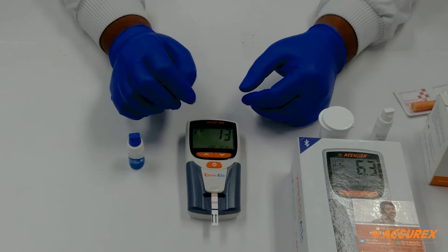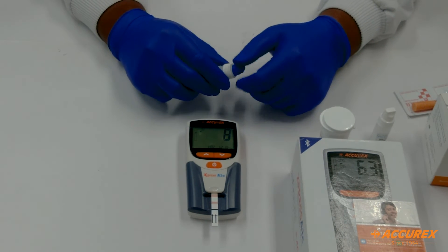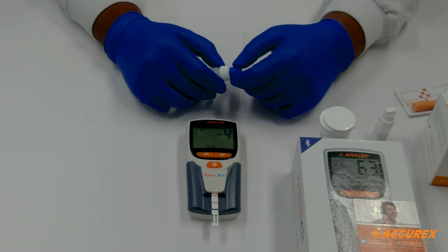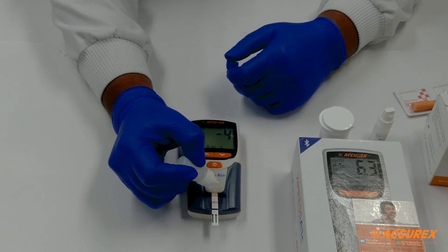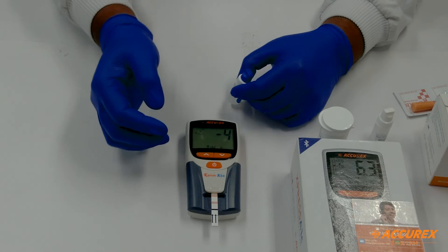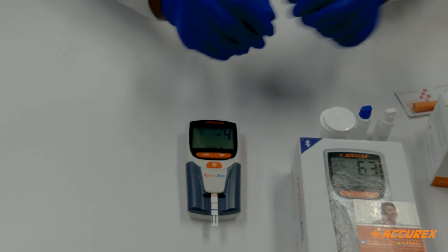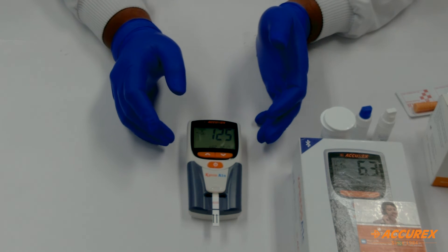Now 14 seconds has been left — be ready with Buffer B. The machine will prompt: please add two drops of Buffer B. Buffer B is added. After adding Buffer B, it will take about 10 seconds to start the read time. Wait for 10 seconds, then it will start the countdown of 130 seconds. After 130 seconds, we will get the reading.